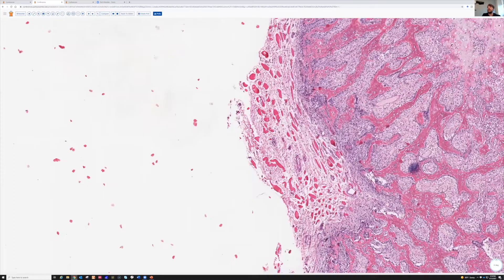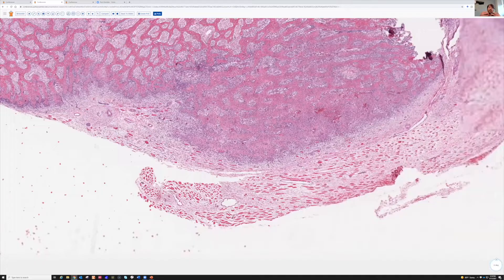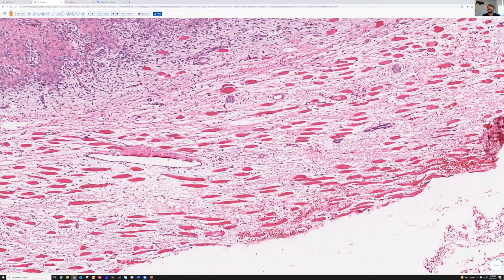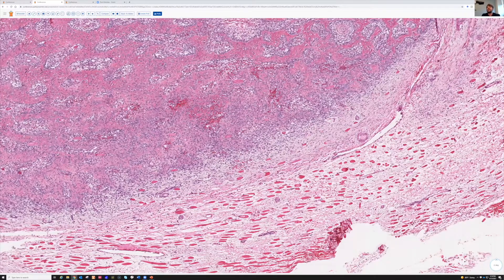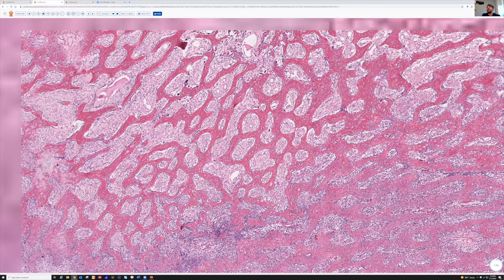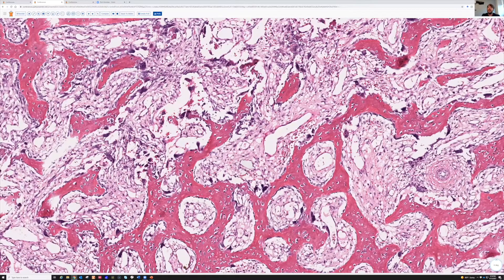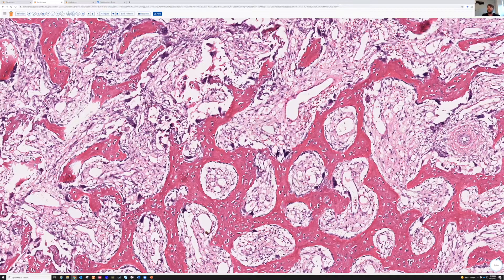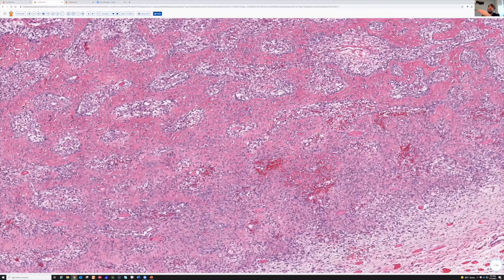Look at the skeletal muscle - there's tons of edema. Each individual skeletal muscle fiber is splayed apart by this edematous loose background and becoming smaller and a little atrophic. So there's a lot of reactive change and edema in the skeletal muscle. Then there's a very robust osteoblast proliferation with woven bone. As we get towards the middle, the bone is still there, but the cells don't look quite as big - not as large and juicy as the ones at the edge. It kind of changes as you go from the outside to the inside of the lesion.